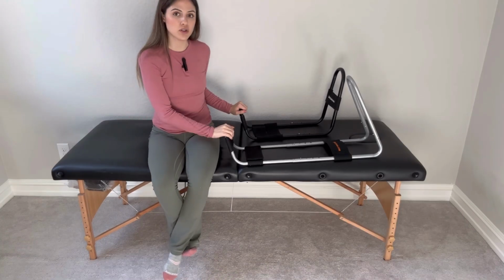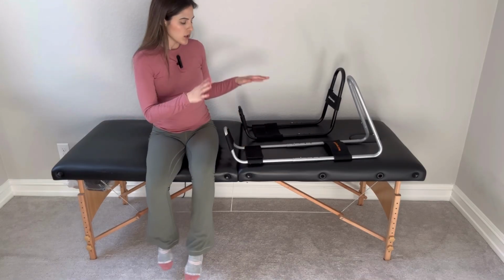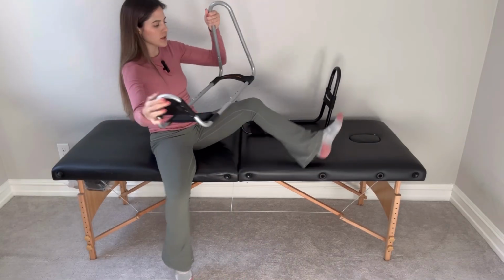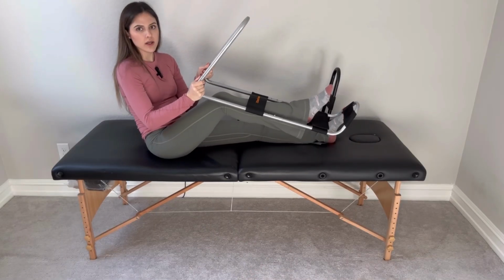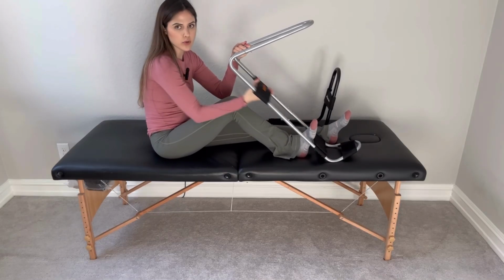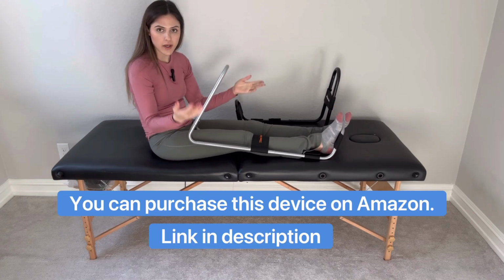But let's go over how to use this, and I'll explain a quick program that you can follow when using this device. So with both devices, you are going to sit up on your bed or on your couch. And what you do here is you're going to put your leg in between these two straps here. So this strap moves back and forth. And then your ankle is going to sit on the bottom strap like a little hammock.